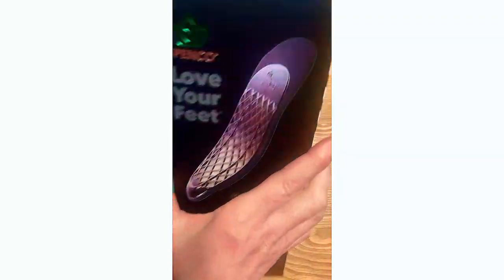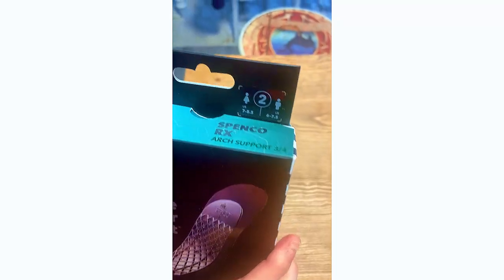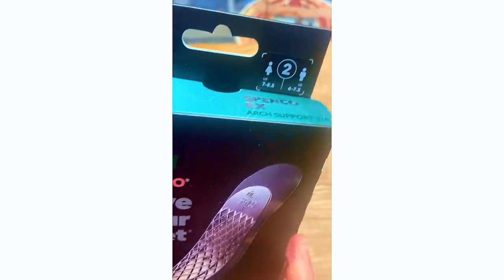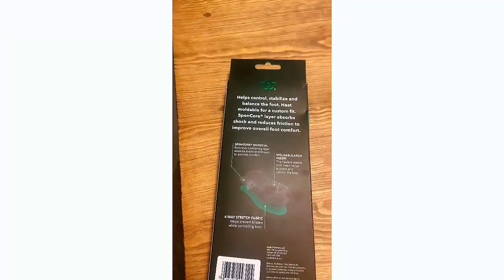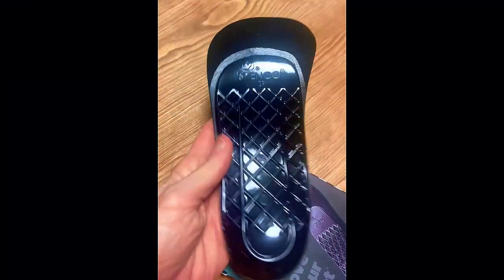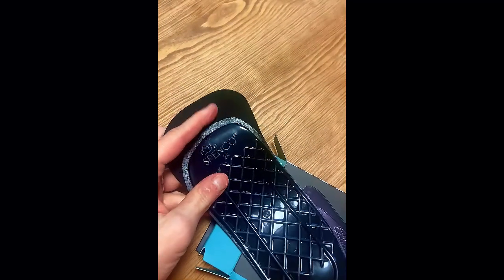Here are the Spenco orthotics — they're now called Spenco RX. I love these for acute plantar fasciitis. The size is on the top, and it's heat moldable, which I like because people can adjust it for their feet. I got the three-quarter length so I have room in the toe box.